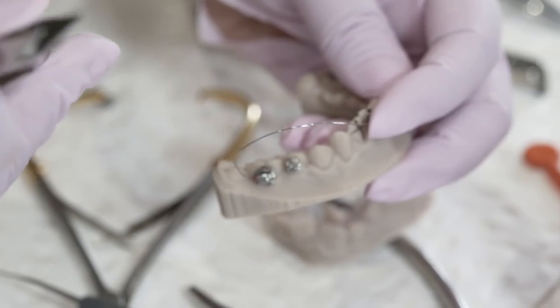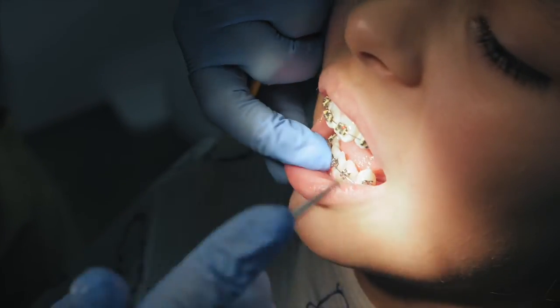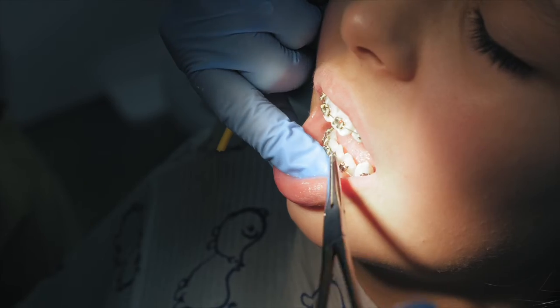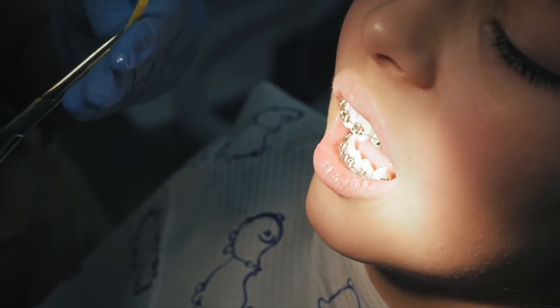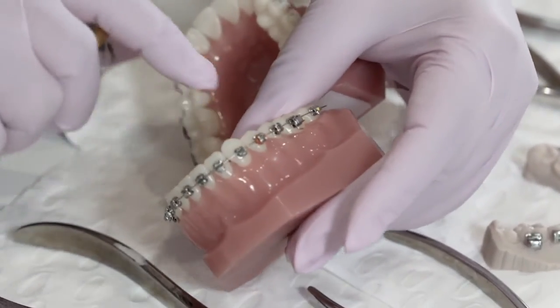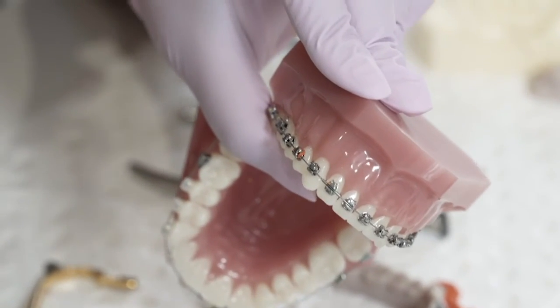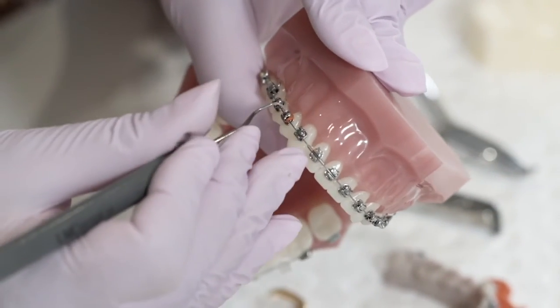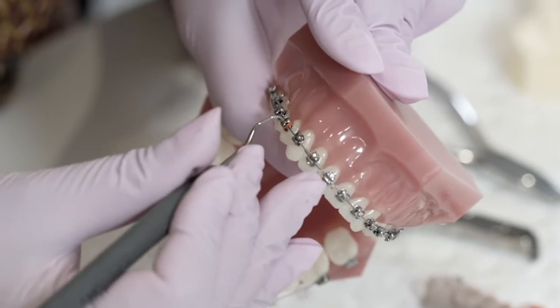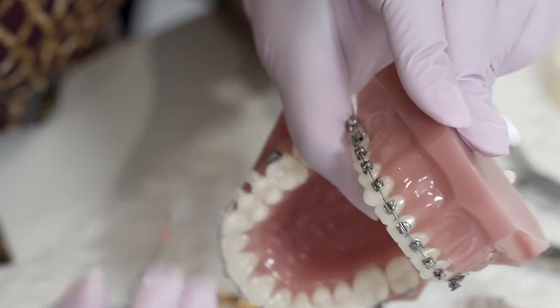If you want to put modules on a full crowded arch that doesn't have self-ligating brackets, you'll need to put elastic modules. I've placed them all around the arch here. If you want to remove an elastic module, you get a sharp scaler, lift it up, and take it out — done.